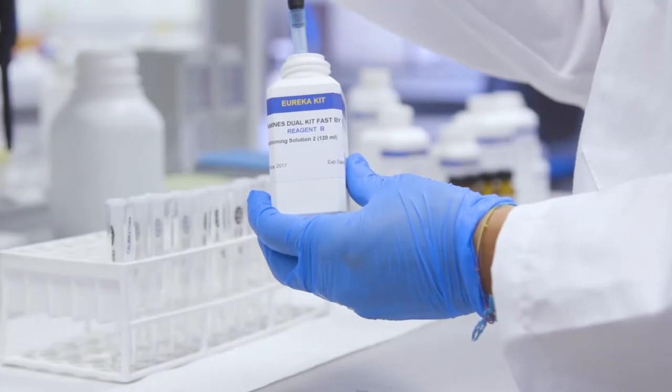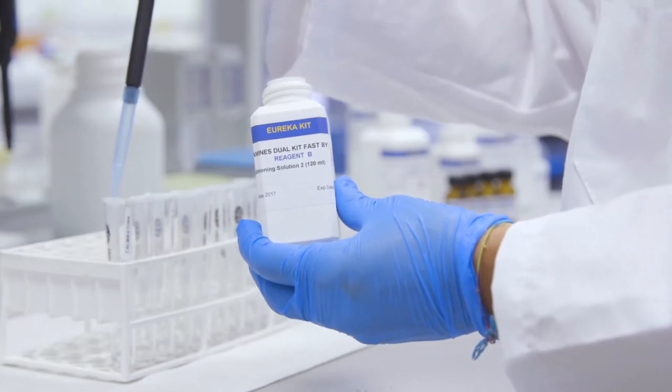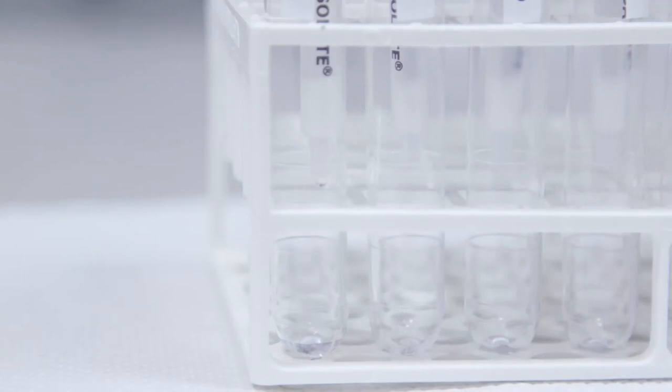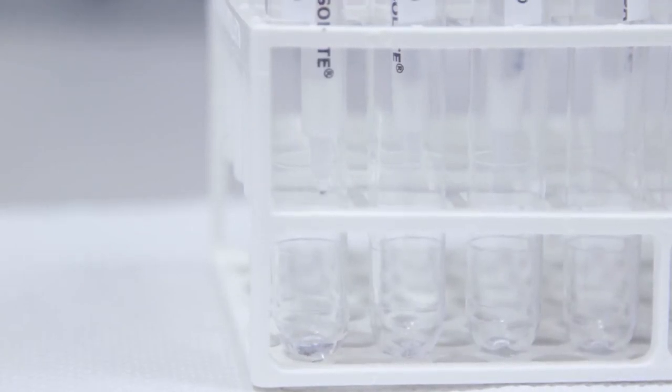Now pour one milliliter of reagent B conditioning solution one into the columns and let the solution flow through the column at a flow rate of one milliliter per minute drop by drop.